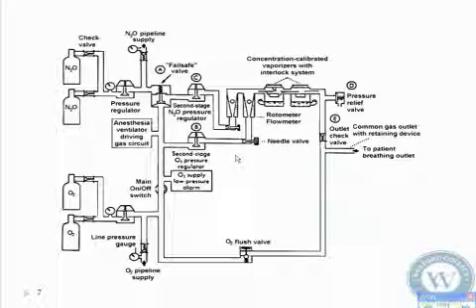You remember that Bernoulli's principle, the Venturi effect? Whenever you have a pressurized system, it's going to shoot out at a very rapid velocity through a narrow margin or through a crack. So if you have a crack here, it's going to suck the oxygen out, all right? And then you're going to get less than the O2 that you were desiring going to the patient. Okay, so it's always placed here now. On all the anesthesia machines since the 90s, O2 is always placed nearest the vaporizer.